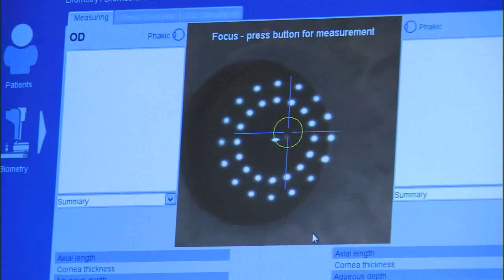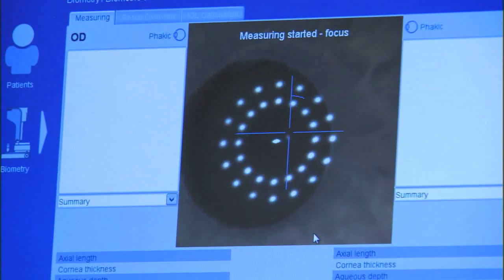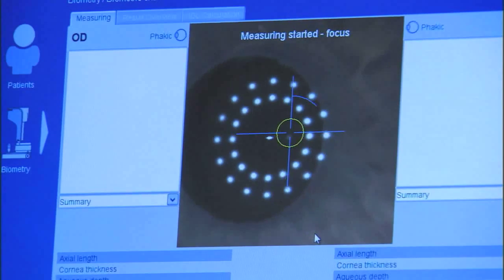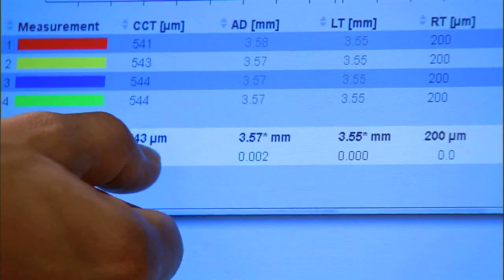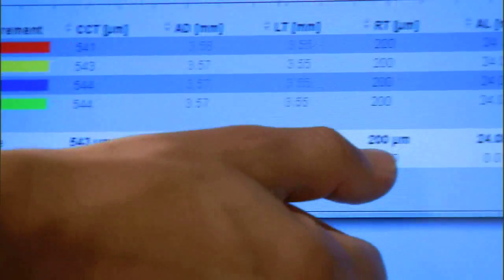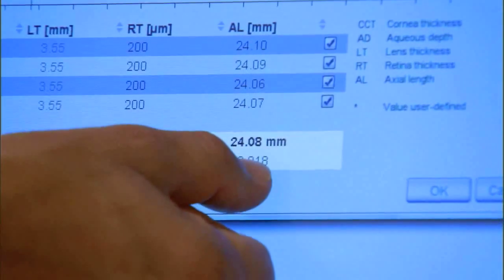With the occluder, fixation is made more naturally and scan time is improved. The axial length measurement features a great deal of advancement.